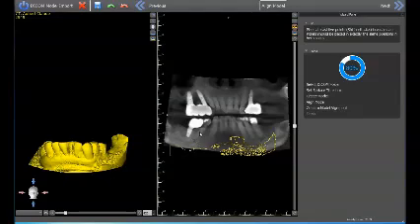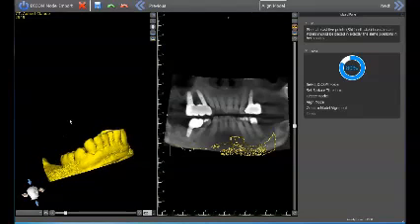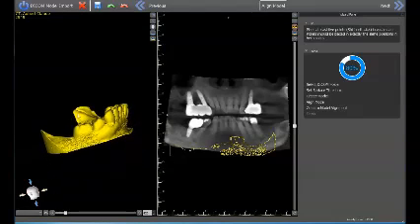So all I've done so far was import the DICOM data, select new patient, import DICOMs, and you'll get this rendering. Then I just added the import DICOM data of the model. And what I'm going to do now is just stitch these two digitally.